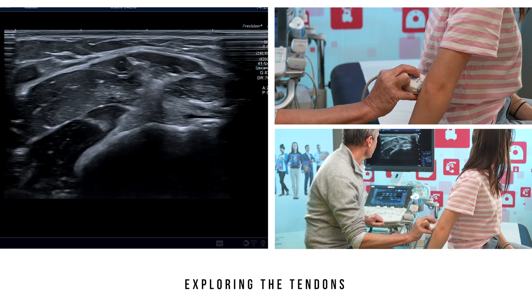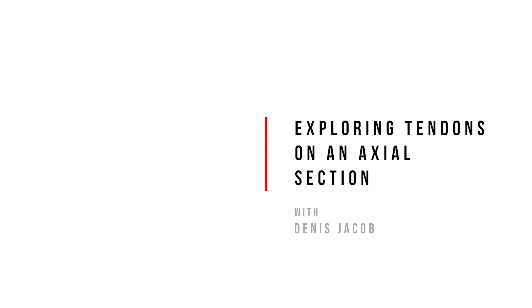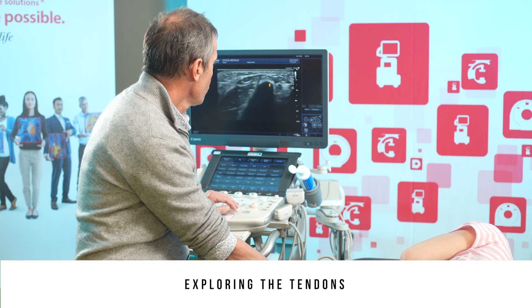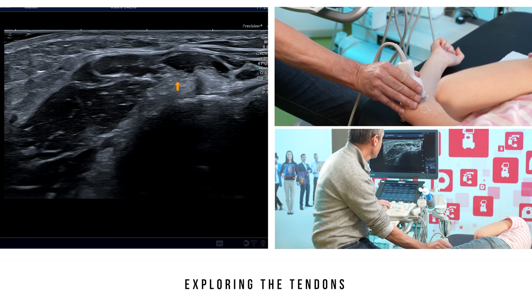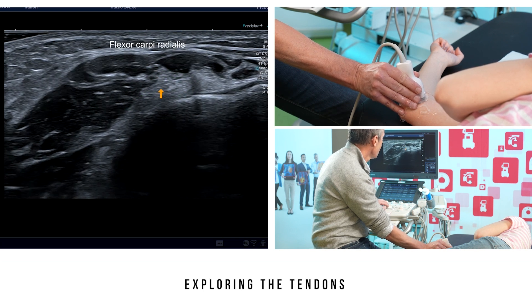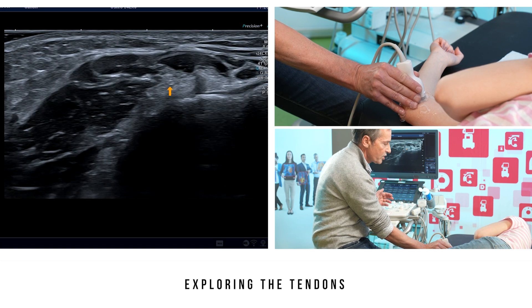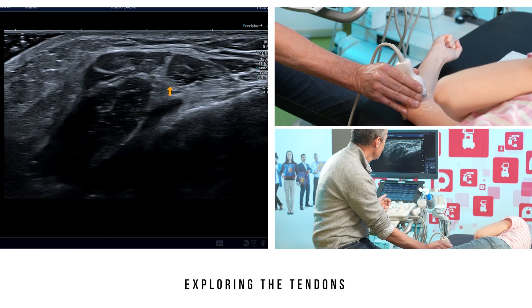This exploration is done in both the frontal and axial planes. After completing the longitudinal tendon analysis, the next step is always an orthogonal view. We can see here a V image. On this section, we can clearly see the superficial relationship of the flexor carpi radialis tendon to the deep flexor digitorum superficialis tendon. To increase the sensitivity for diagnosing potential tears, we ask the patient to make a fist, which can reveal tears that are not otherwise visible.